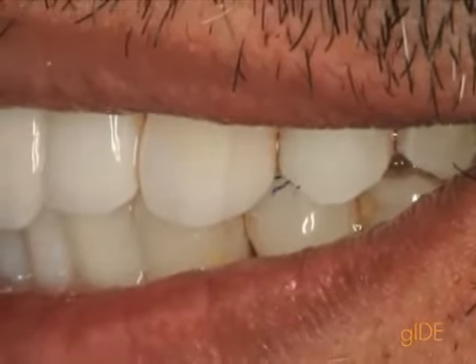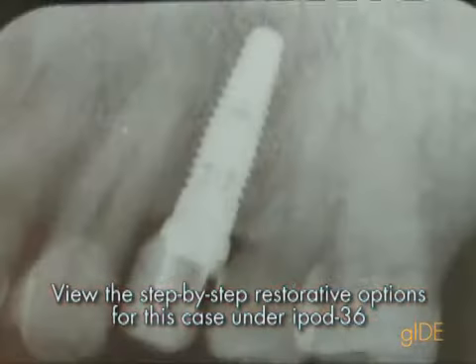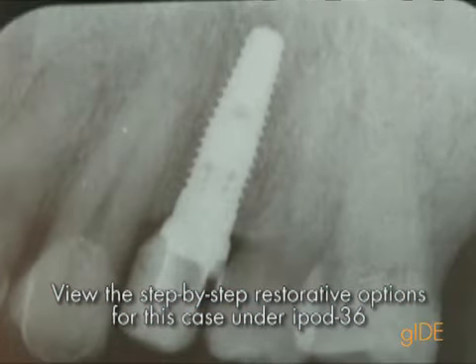A radiograph is taken to evaluate the proper placement of the abutment as well as the proper emergence of the restoration.